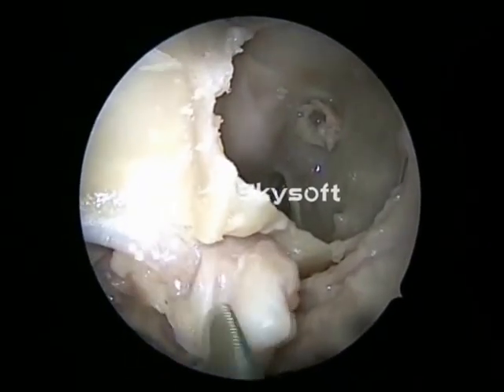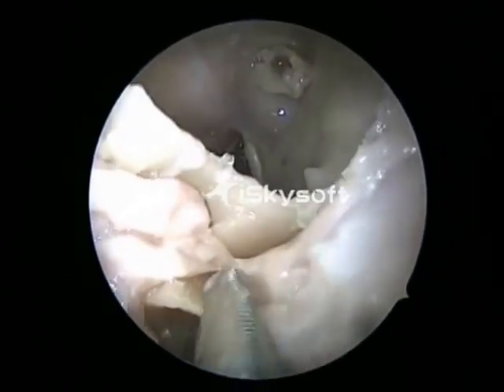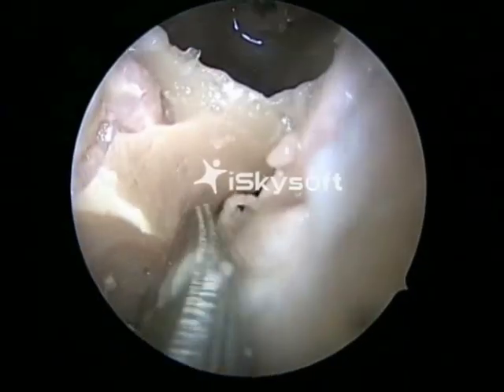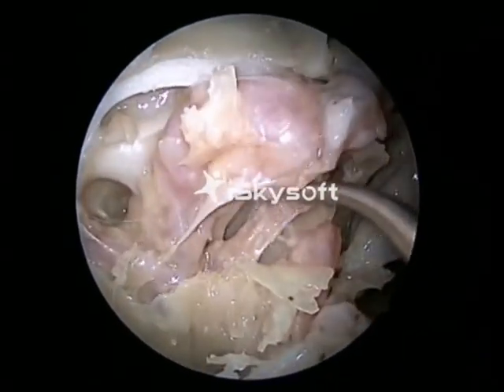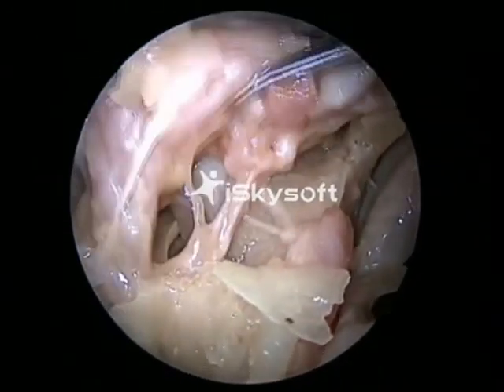That's the Vidian canal there. In fact, that's a very important landmark for the internal carotid artery. That's the palatovaginal canal, internal maxillary artery, the Vidian nerve coming and joining the pterygopalatine ganglion.